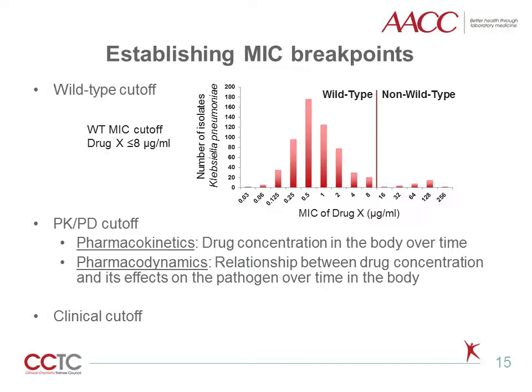Breakpoints can be revised and updated with shifts in wild-type cutoff, new data on PK/PD, and changes in clinical outcome. In fact, organizations establishing breakpoints, like the CLSI and EUCAST, constantly review data and hold discussions to ascertain whether changes to existing breakpoints are warranted and undertake studies in reassessing breakpoints.